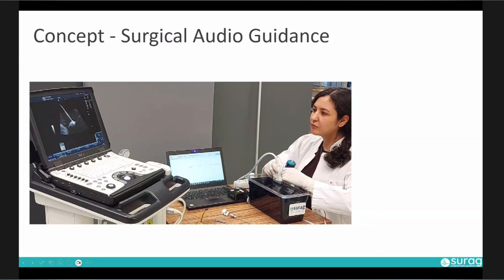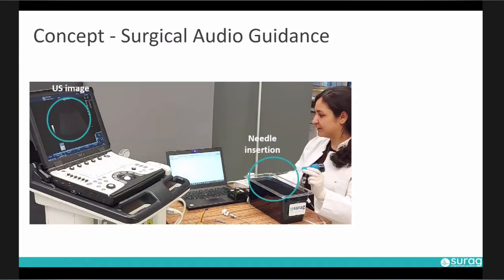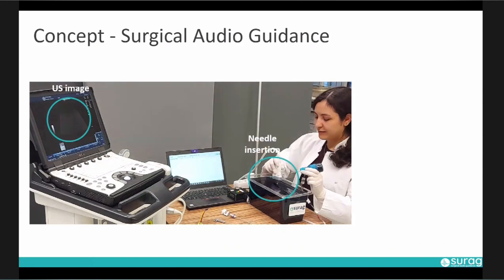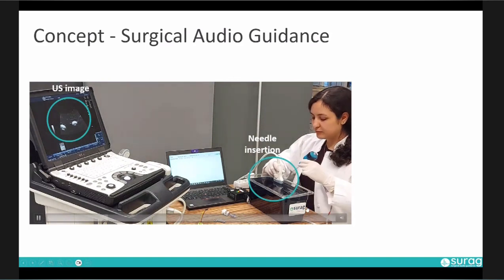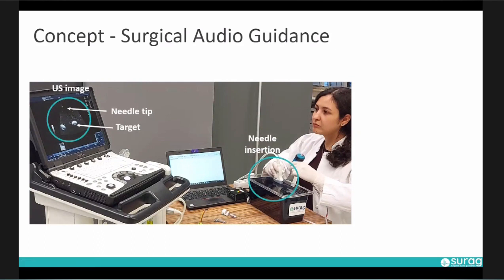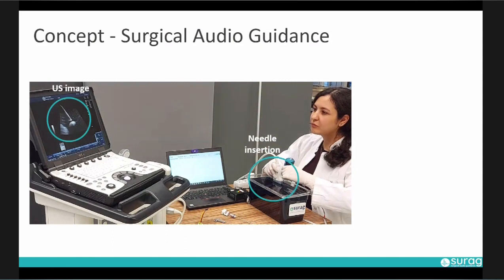We will start again. So you see here. Can you hear now? I hope yes. So you have the biopsy needle, and now Nancy will start to insert. We ask surgeons; surgeons in general don't feel when they are entering the olive.